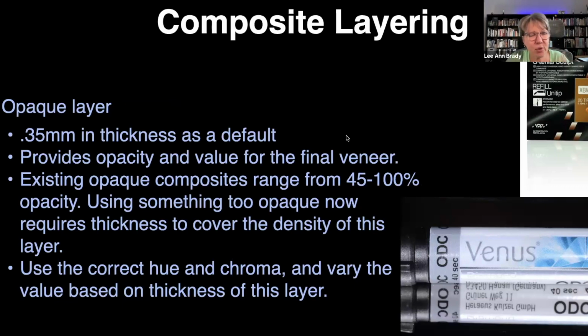So if it's a through and through class 3, the layer that's going to be on the lingual, class 4, incisal edges are a little different, because if it's a true incisal edge, it may be translucent through and through. But if you need to put an opaque composite, if you need to put a bleach shade, because the tooth you're matching is reasonably opaque, higher value, is bouncing a lot of light, you always want to put the most opaque composite on the lingual side of the tooth, or to the lingual of the preparation. Okay. So it becomes the lingual wall of the restoration.